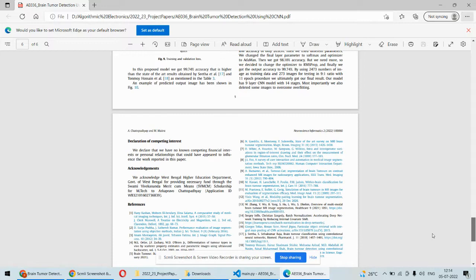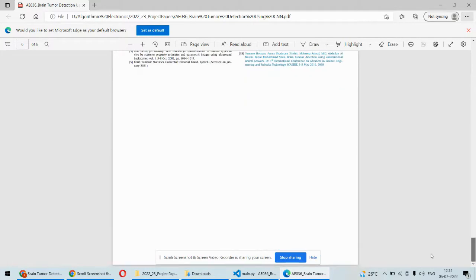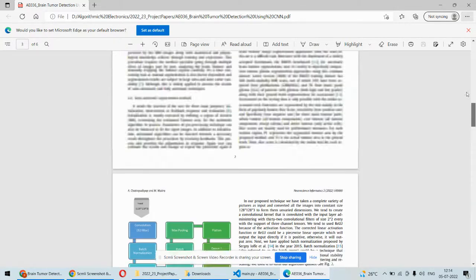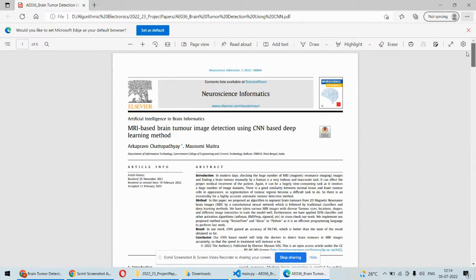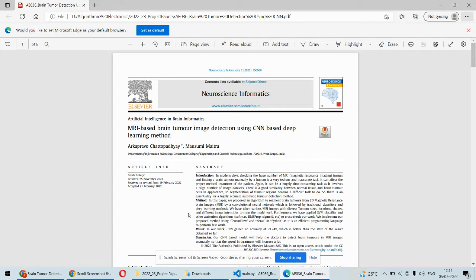Similar approach we are going to implement over here. Additionally we are going to add a GUI or graphical user interface to this particular project. Now let's see the implementation part of this project.